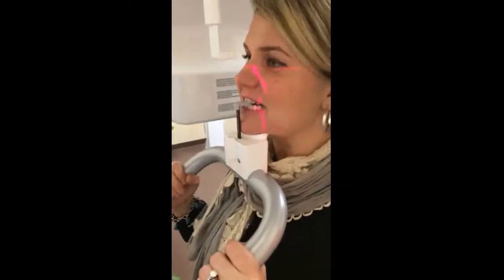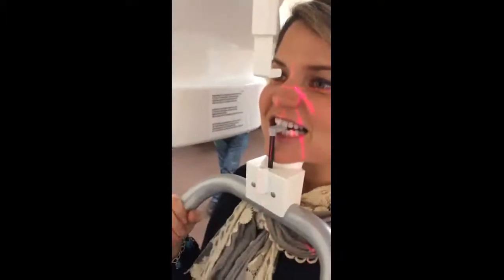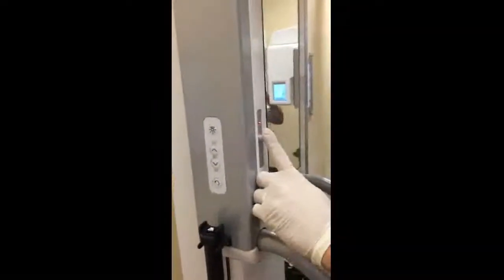The patient's going to see a line down the center of their face. Ask them to get that in the center of their philtrum. Don't use somebody's nose. Noses tend to be crooked. There's a little silver tab on the left of the mirror. This sets the light on the bottom of the eye socket here.